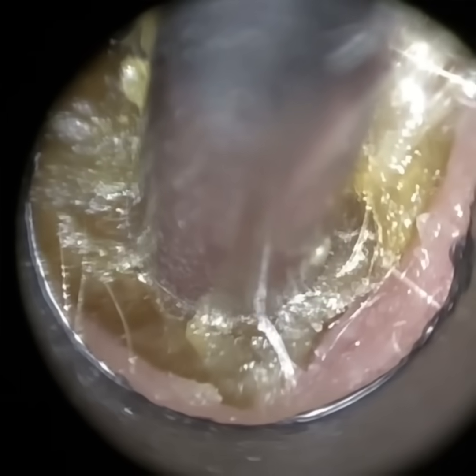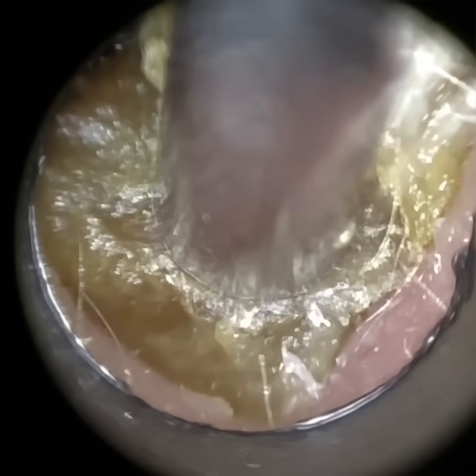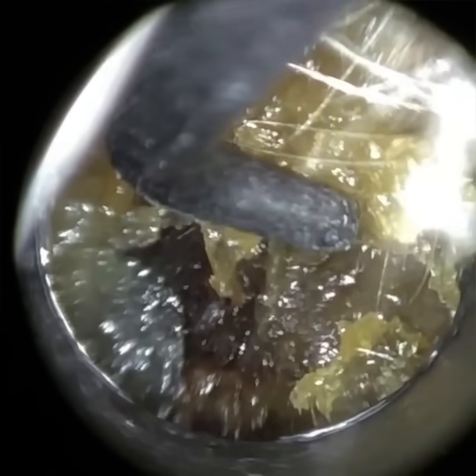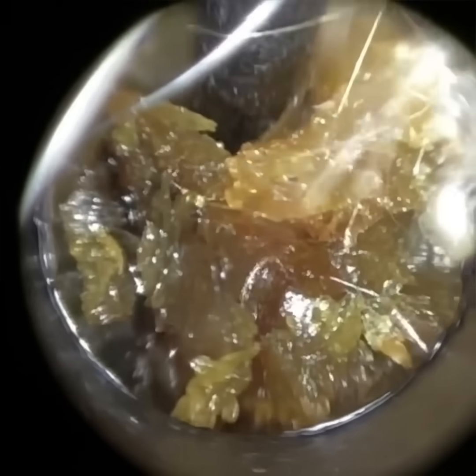So of course hearing aids help you hear, but they can also help hinder the natural migration of dead skin out of the ear. Our ear canals and the outer layer of the eardrum, which is three layers thick, is lined with skin, the epidermis layer, and as that skin dies and is replaced by another layer of skin underneath, it's pushed forwards and it begins to shed and migrate. Dead skin in the ear migrates sideways, it should do, out of the ear, like a conveyor belt. And any wax sitting on the surface of the dead skin on this conveyor belt is naturally transported out of the ear.